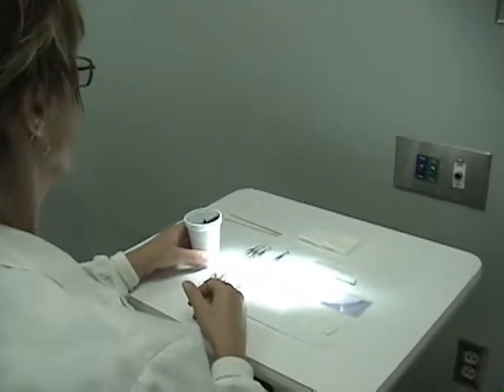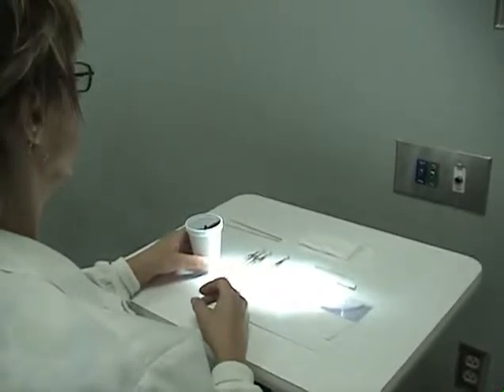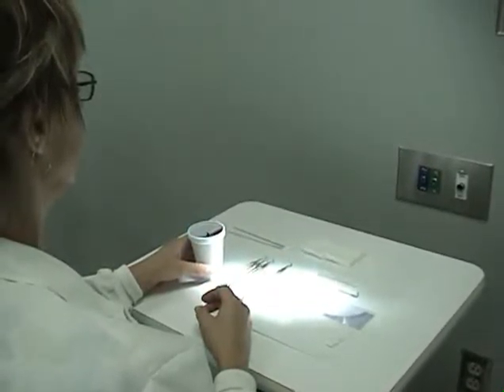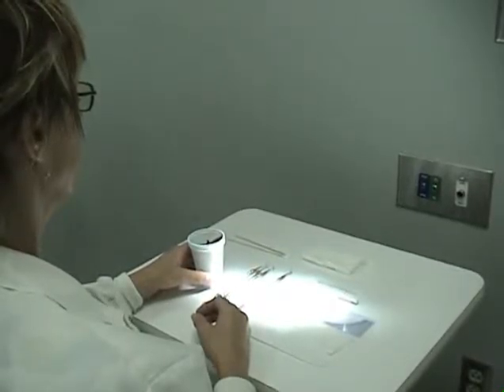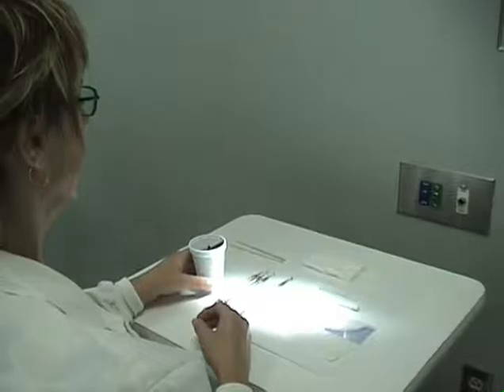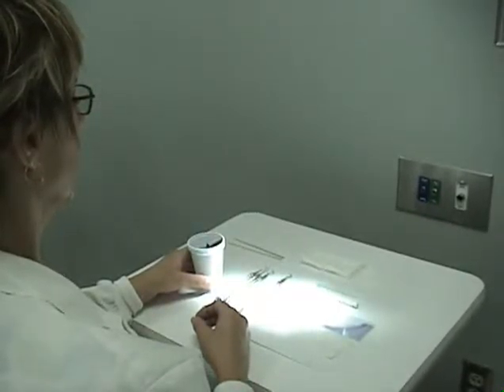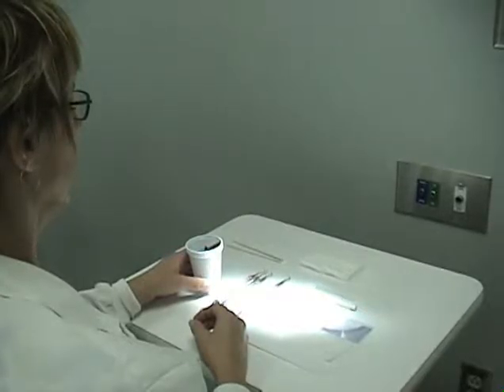Instruments should be kept sharp for the following reasons: reducing hand fatigue, improving deposit removal, avoiding burnishing calculus, it will save you time, it will improve your tactile sensitivity, and most importantly, it will minimize your patient's discomfort.